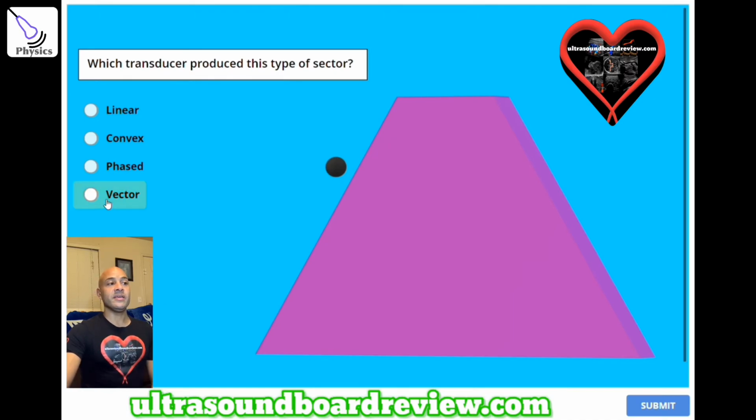The answer is D. Vector. A vector transducer will produce a flat top sector.